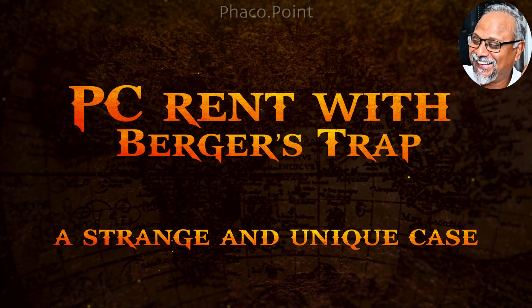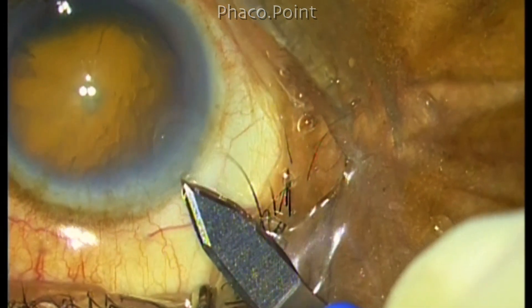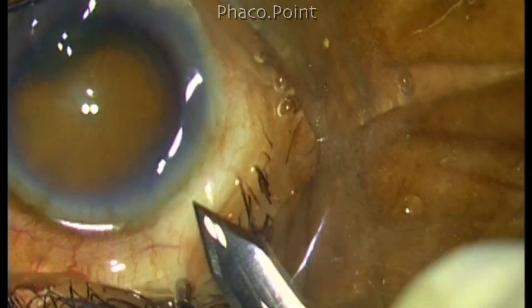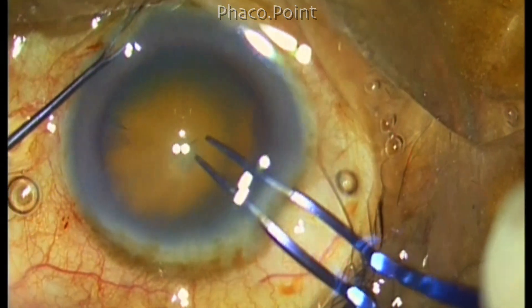Hello my dear friends. In this case I encountered a strange and unique finding which I'd like to present. So let's get started with the creation of the clear corneal incision and let's run through the initial stages of the procedure quite fast, because the peculiar finding occurred towards the end of the procedure.